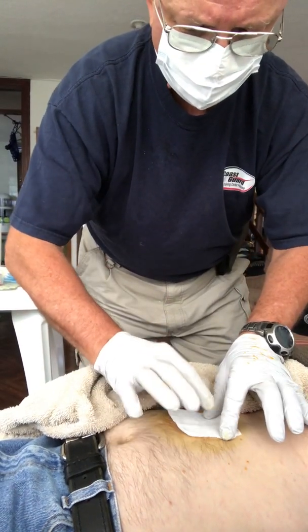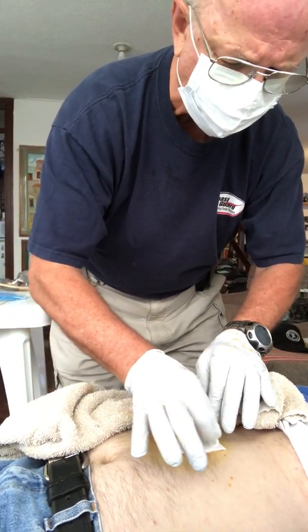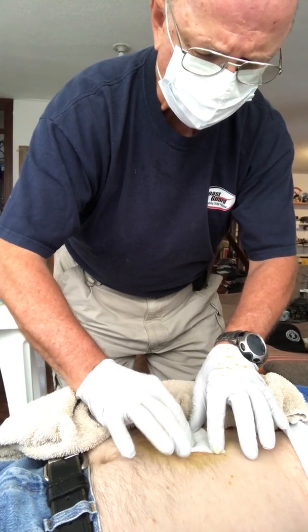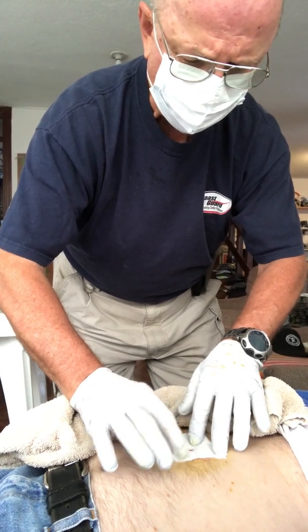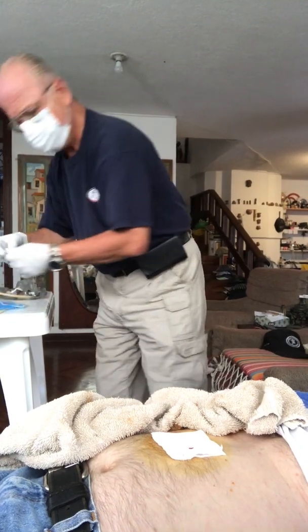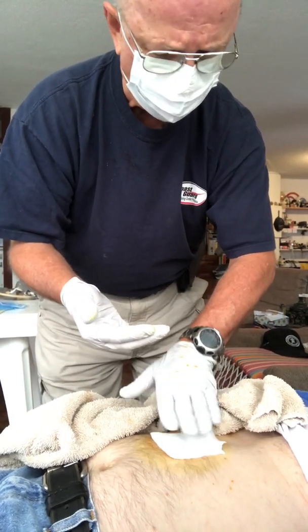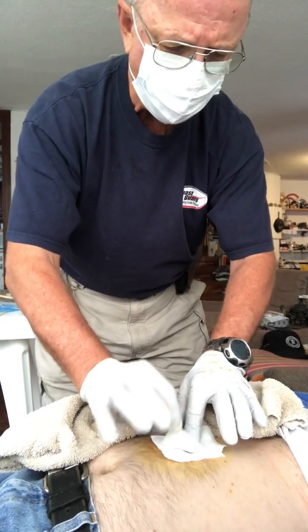You can center it. Okay, now this gauze has several layers. Like I said, when you take it off, don't yank it off. It's going to be a little cauterization there. And don't pull the scab off. The scab will protect you. The top layers of the gauze, like this one I'm putting on here, will absorb some of the bleed through or the fluid. Sometimes you have a little bit of stomach fluid coming through until it closes up. This one you can change.